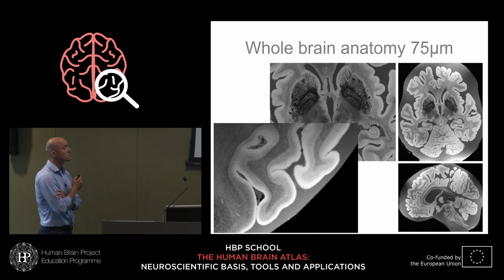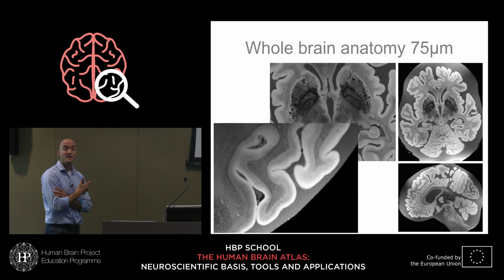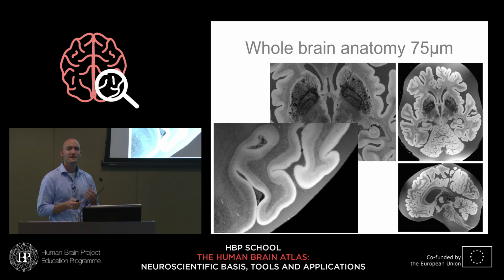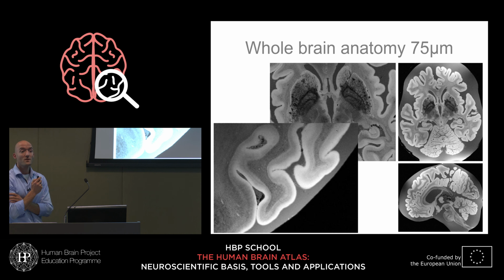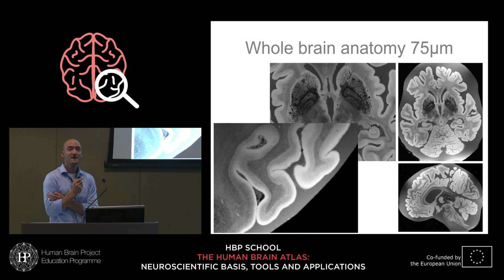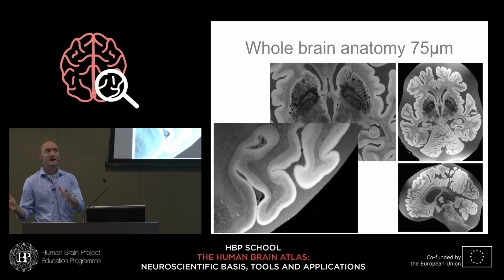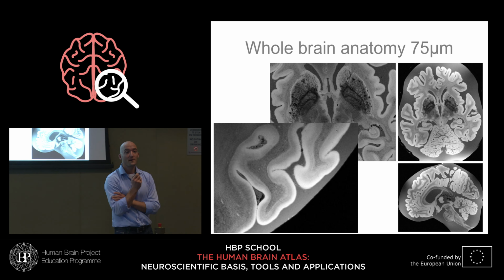So in principle, we have the potential here, you could say for the first time, to look at myeloarchitecture over the entire human cortex, and it's intact as well. You might have heard in the past days, I cannot imagine that Carl or Katrin or Svenja has not told you this, that the Vogts did a lot of work on myeloarchitecture, but they were so incredibly thorough that they never got to doing the entire myeloarchitecture of the entire cortex, right? So a lot has happened since. Yeah, the myeloarchitecture has perhaps been underappreciated for the last 100 years, but it's also not seen no work. But still, there's a lot not understood yet.